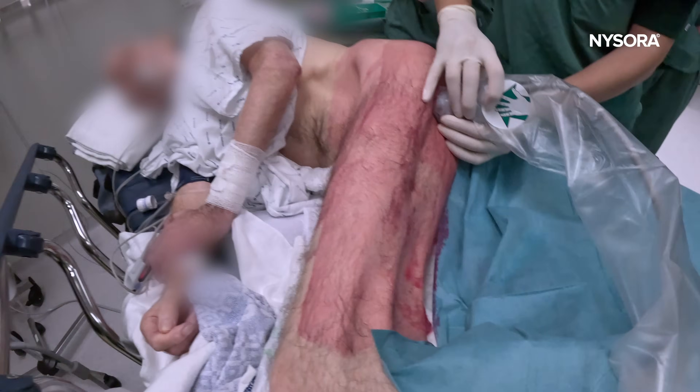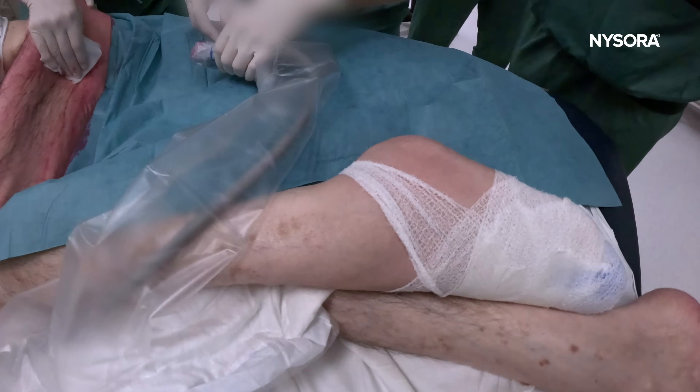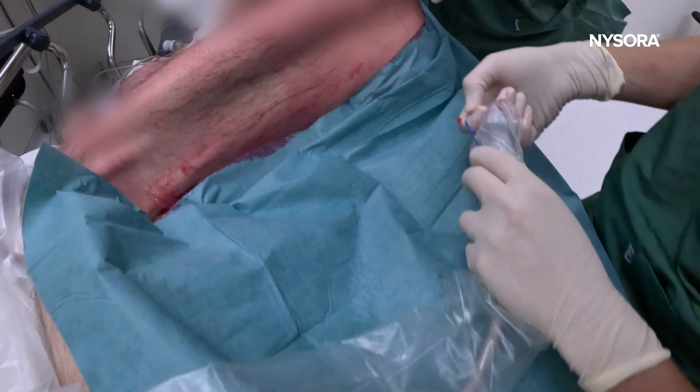This is an excellent indication for Exparel — for compassionate care in patients having above-knee amputation. That was a video on how to combine femoral and sciatic blocks for above-knee amputation in a severely ill patient in whom general anesthesia was deemed risky and spinal anesthesia was contraindicated due to anticoagulation.